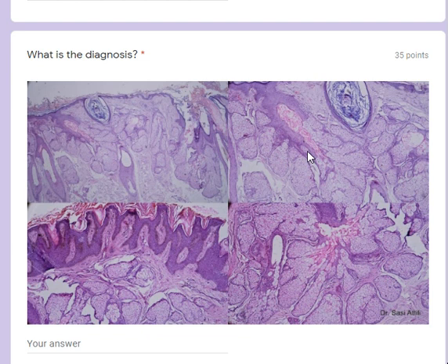Often in the early stages, one may see a number of immature follicular units. You see hair follicle units like this without any sebaceous glands. So comedonal lesions are also common within it. But in the later stages, after puberty, after maturity, you often see this type of picture. So this is a typical picture of a nevus sebaceous. The clue is sebaceous glands opening directly onto the surface associated with some epidermal papillomatosis, some warty change.